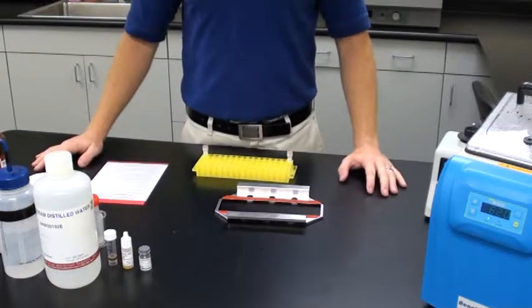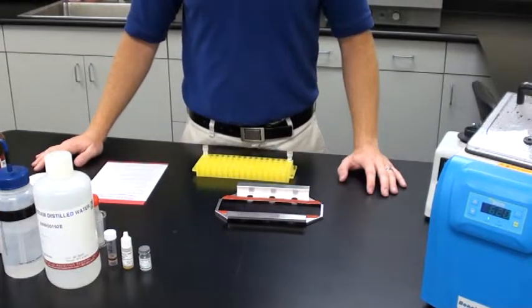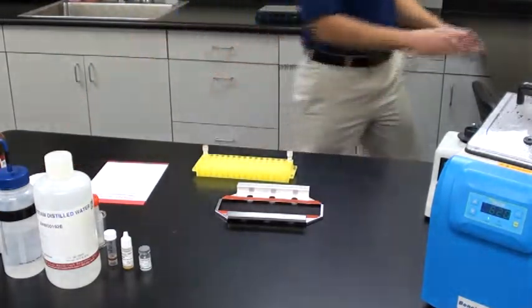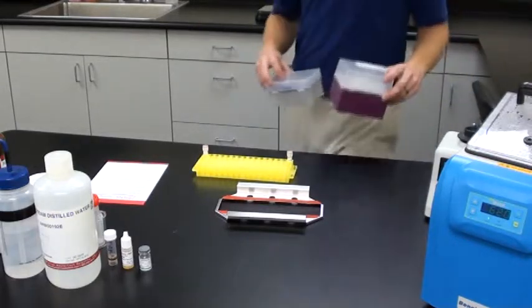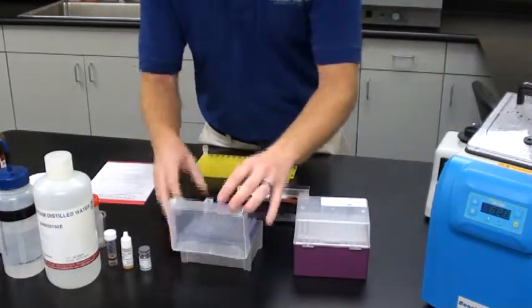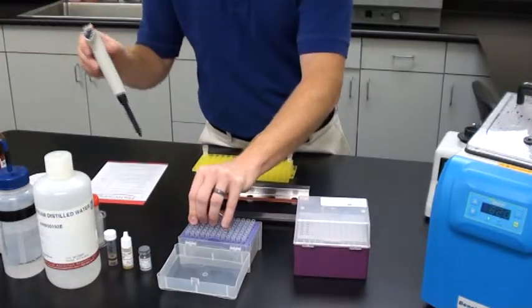Alright, well here we are in our station ready to perform our very first ExISH procedure. The first step is going to be to reconstitute our DNA probes by adding 65 microliters of steam-distilled water to the probe.